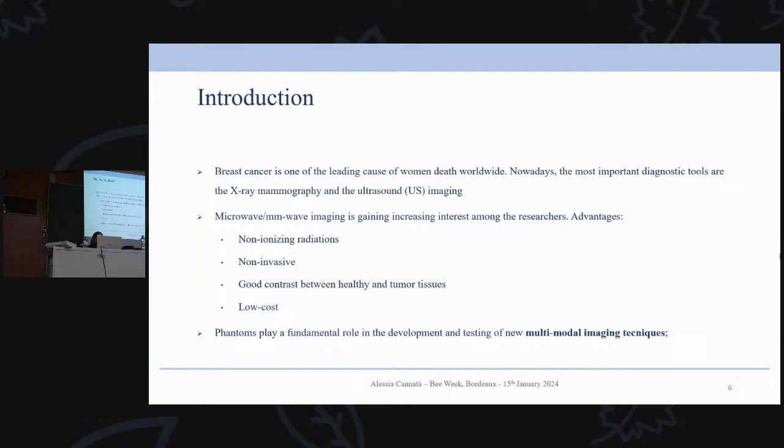And the second point is that these novel techniques are meant to be non-invasive. So for example, X-ray mammography requires the compression of the breast, which is sometimes not tolerable by women. So a woman sometimes decides not to go to the screening test because it is annoying. And a technical advantage of this technique is that it can provide a very good contrast between the healthy tissues and the tumor ones due to the water content of them. We will see it later. And last but not least, the resources that are meant to be employed are very low cost.